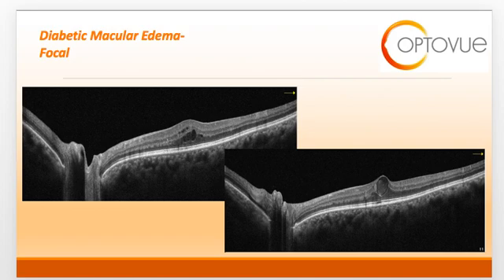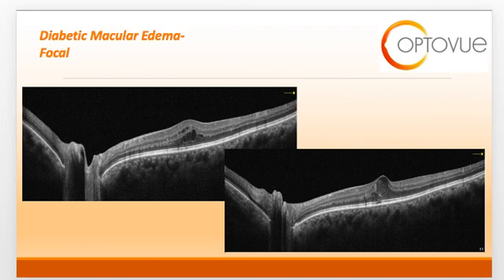You might want to also take note of whether or not the diabetic macular edema is involving the fovea, or what we like to call center-involved diabetic macular edema. Center-involved DME has much more of a worse prognosis than non-center-involving DME and requires urgent referral to the retina specialist.